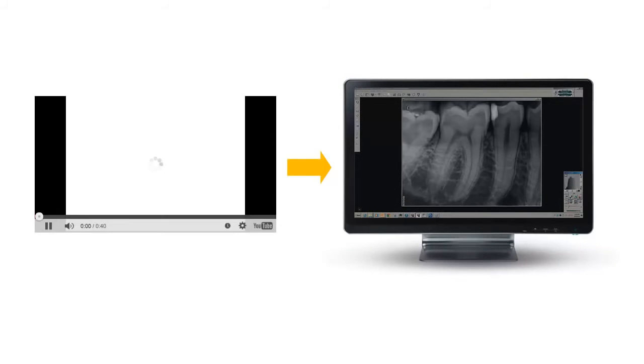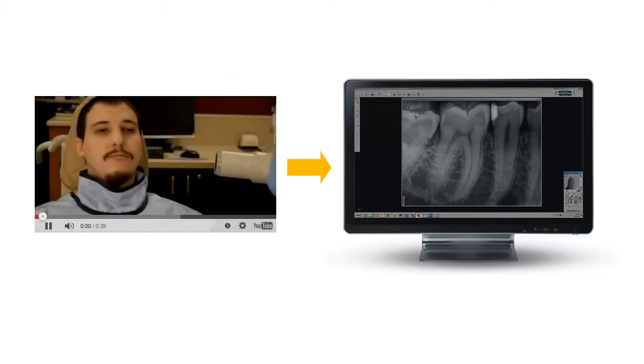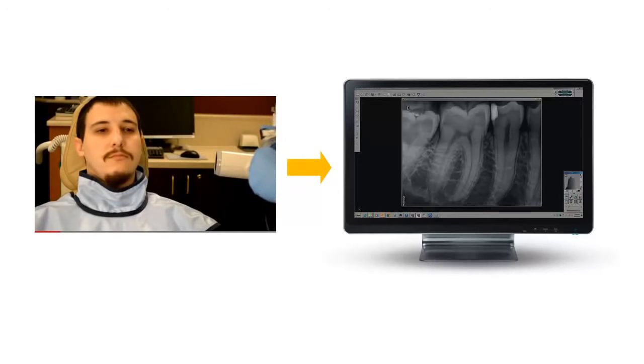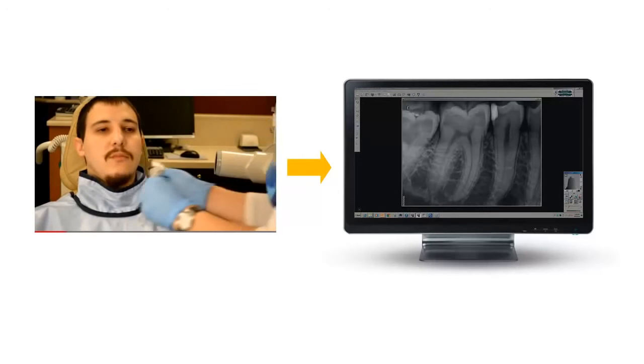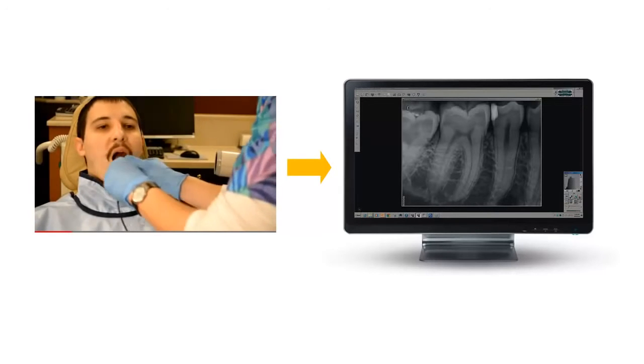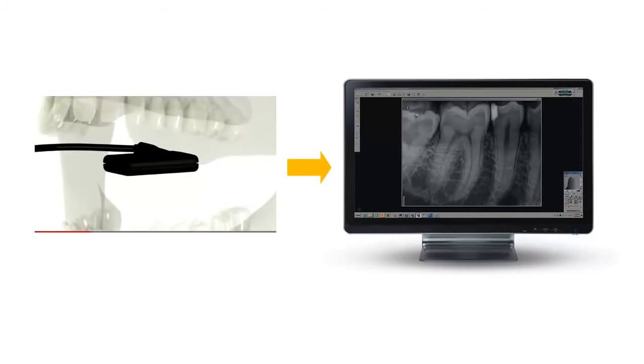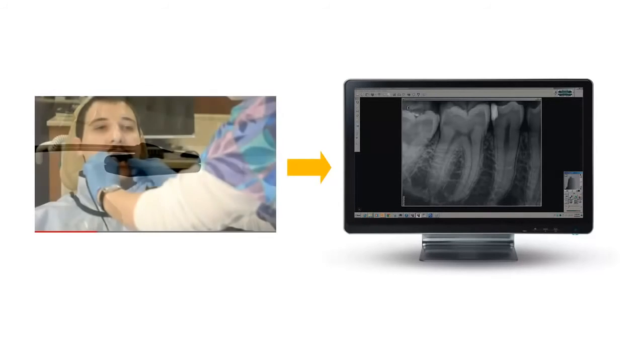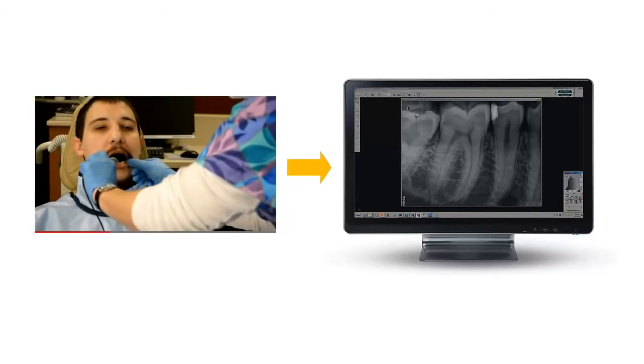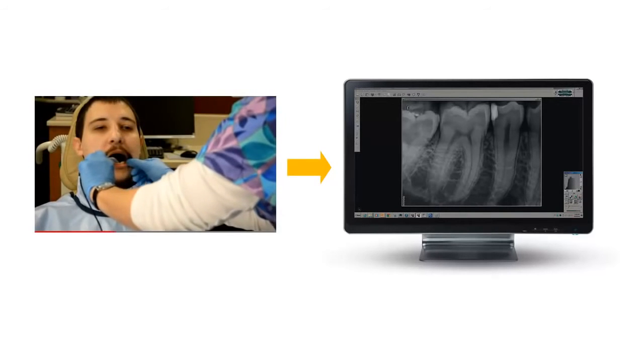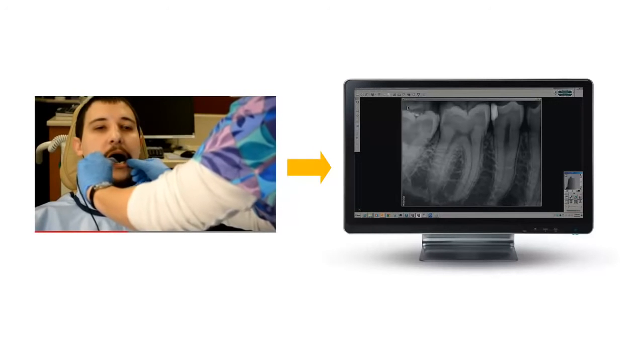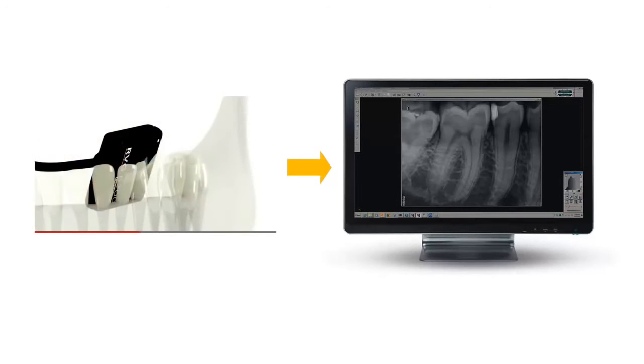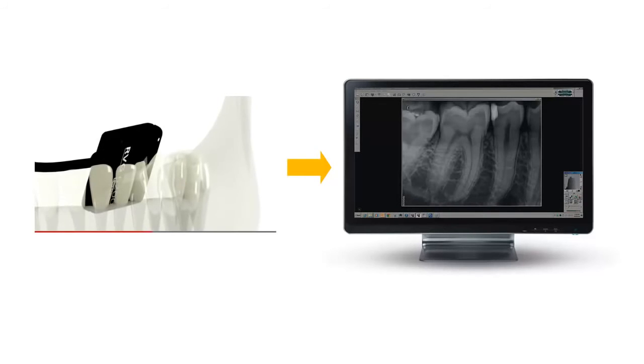The digital image from the sensor is transferred directly to the imaging software program where it can be saved, viewed, edited, and manipulated. Because the image is processed automatically, it is displayed in the software instantly, so you no longer have to wait for film development. With the RVG sensor, simply position, expose, and view your images.